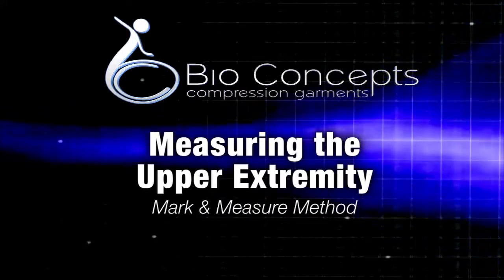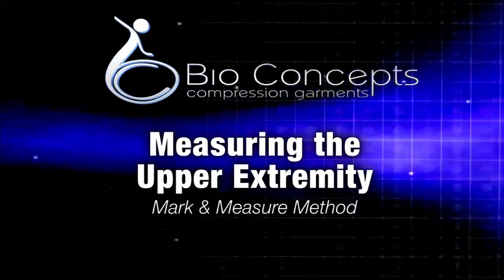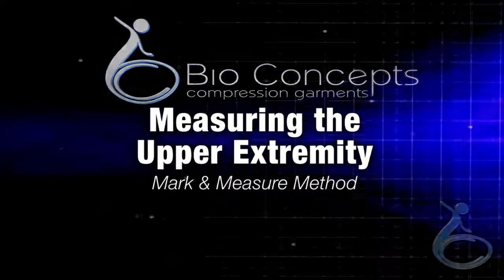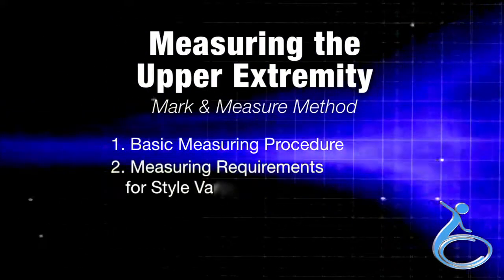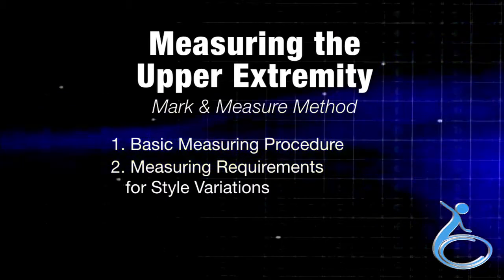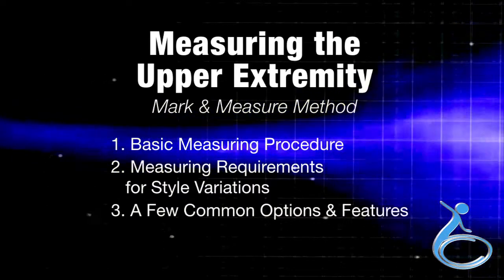This video will demonstrate how to measure the upper extremity using the mark and measure method. The video will cover three areas: basic measuring procedure, measuring requirements for style variations, and a few common options and features.